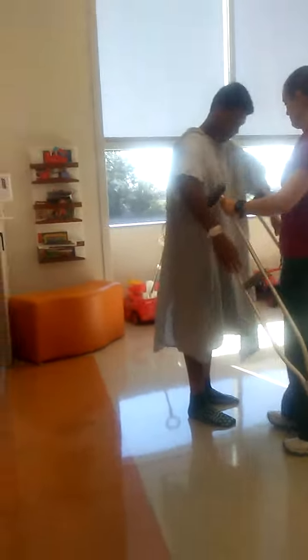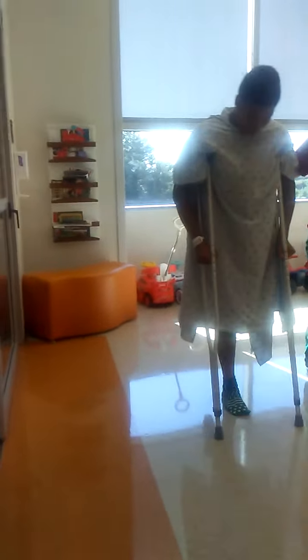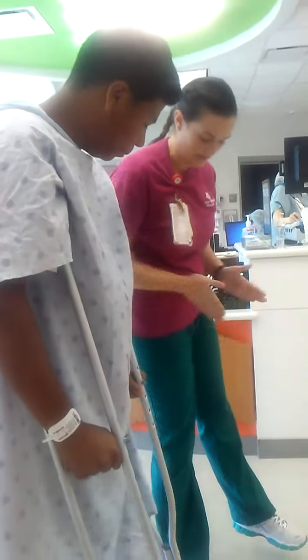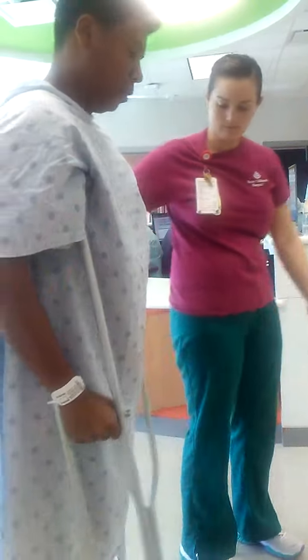Okay, so you're going to practice a couple times. You may be in a brace system — a brace that keeps your leg straight. So try and just keep your leg straight and off the ground. There you go.